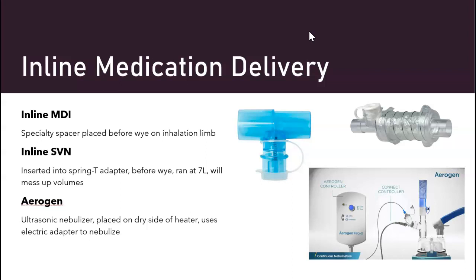You will have to take it out of the boot, the little boot thing, and then try your best to time it with your patient. But overall, it's going to be within the sealed system, so it'll get to your patient eventually. But that's the inline MDI spacer. That's one of the things we'll have you guys practice.